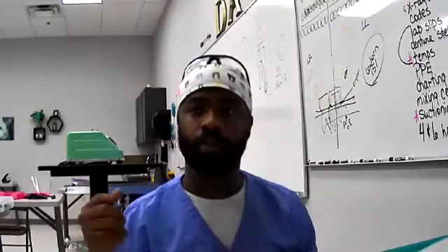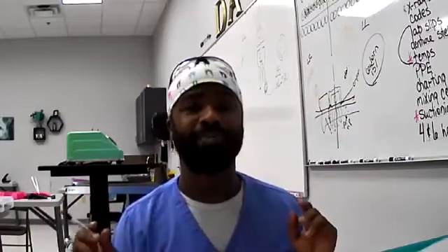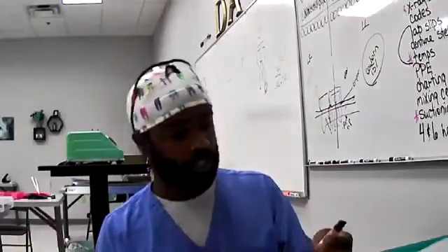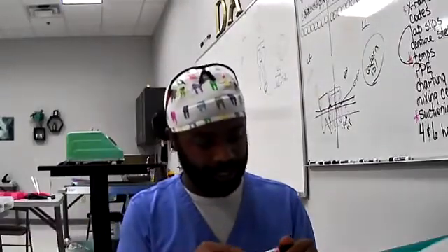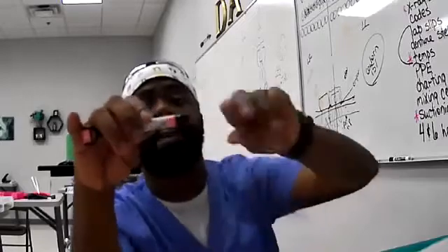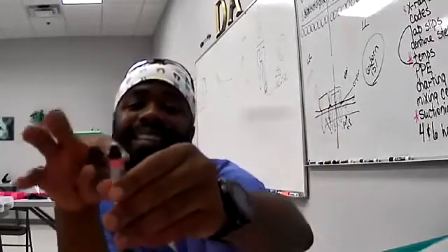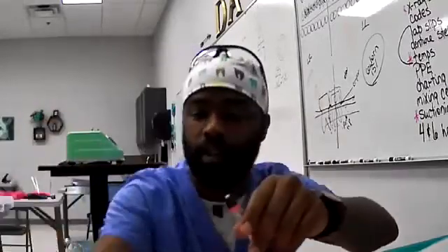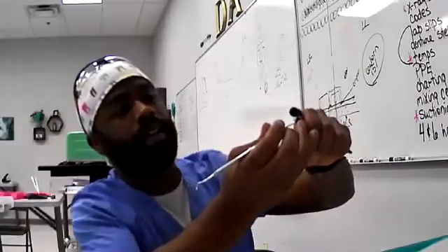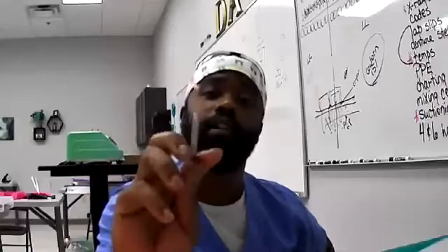Most of the time, flowables and packables are used for the back posterior teeth, only because you're putting more pressure on them whenever you're eating and talking. We also have this one, which is a packable and a glass ionomer at the same time. This would be used for the anterior teeth. You can use it for posterior too, but in this case, this one would probably be for an anterior tooth, because of the viscosity, and it makes it way easier to cut for a front tooth.